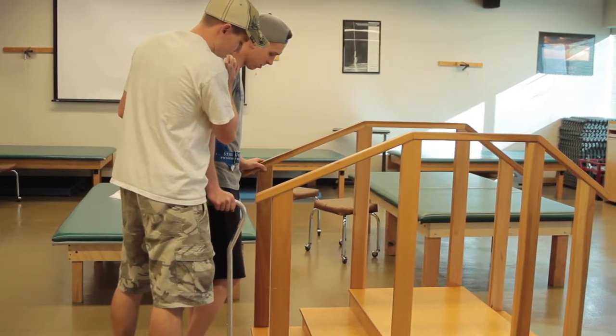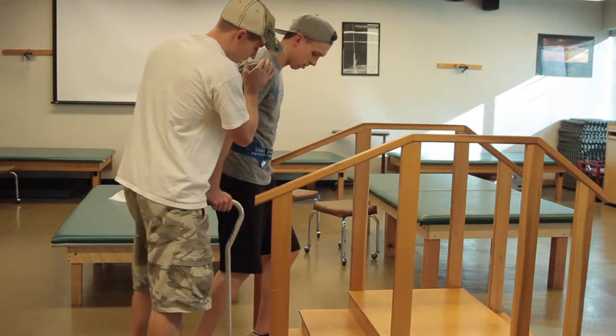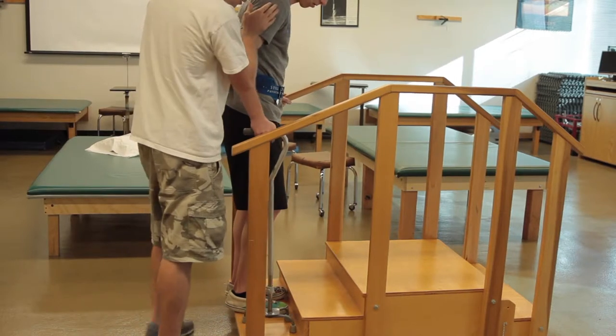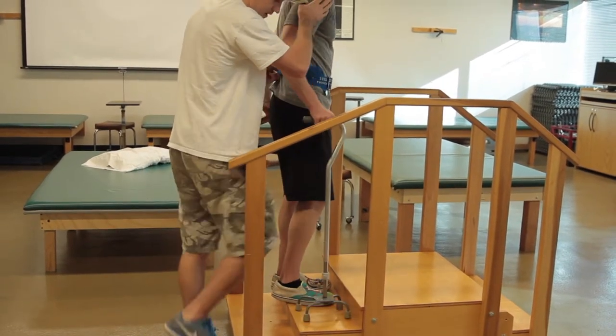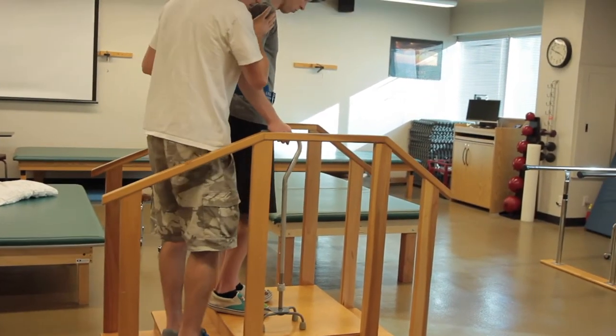So you're going to first go up with the good foot, putting pressure in that arm, and then, yep, bring up that other foot, and then follow with the cane. Perfect. So up with the good, perfect. And same thing, up, and follow. No pain with that. Nope.